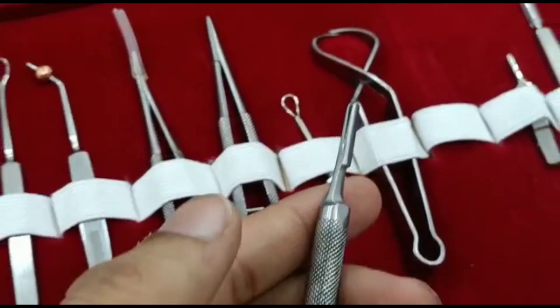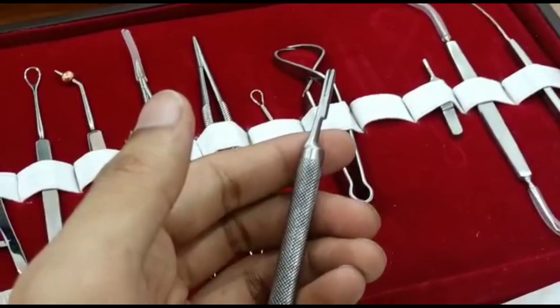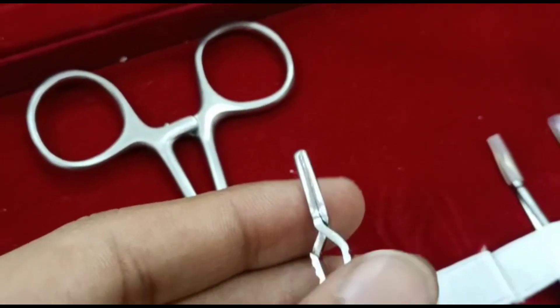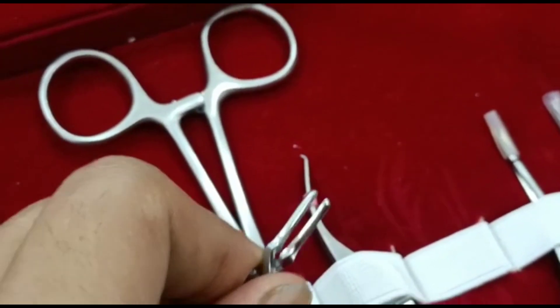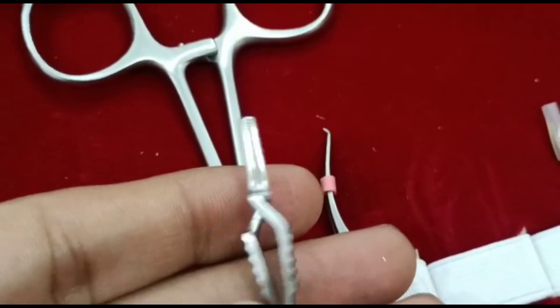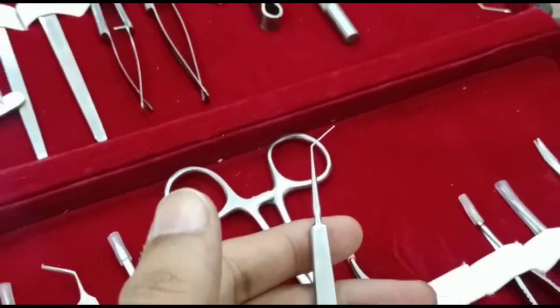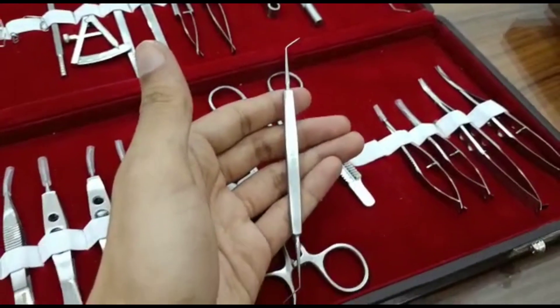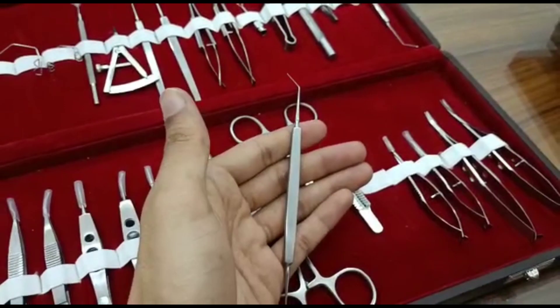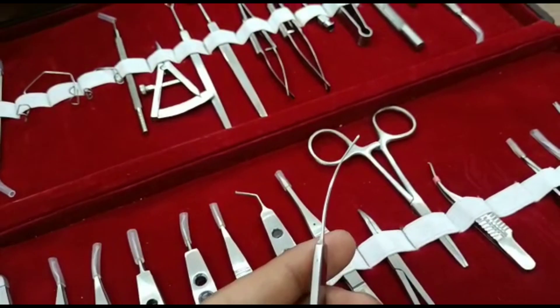BP handle. Serafine bulldog clamp. Lens spatula double ended. Iris repositor double ended.